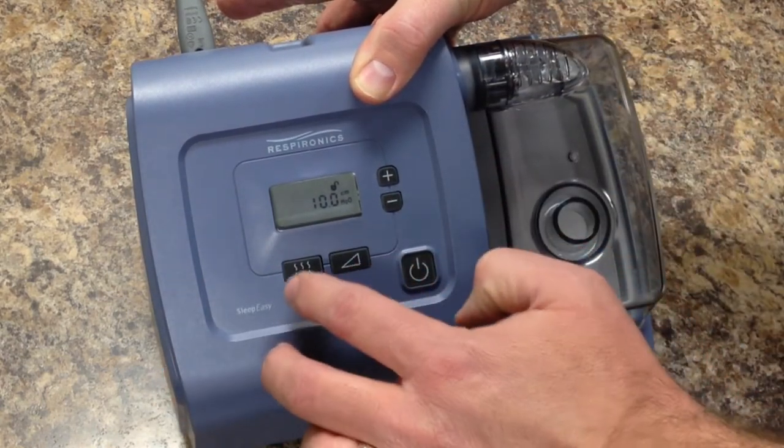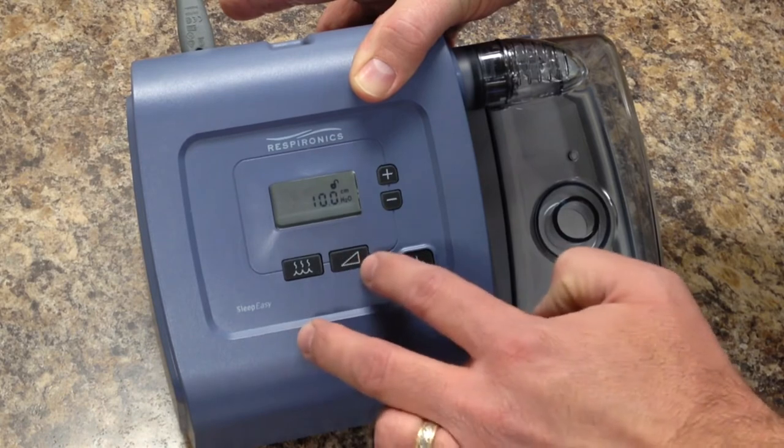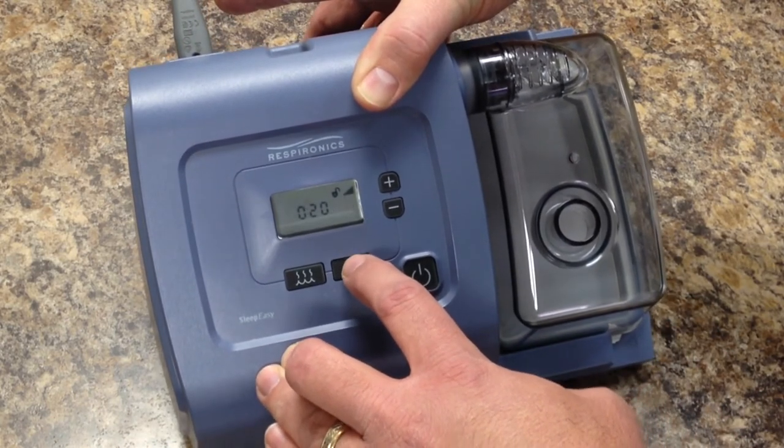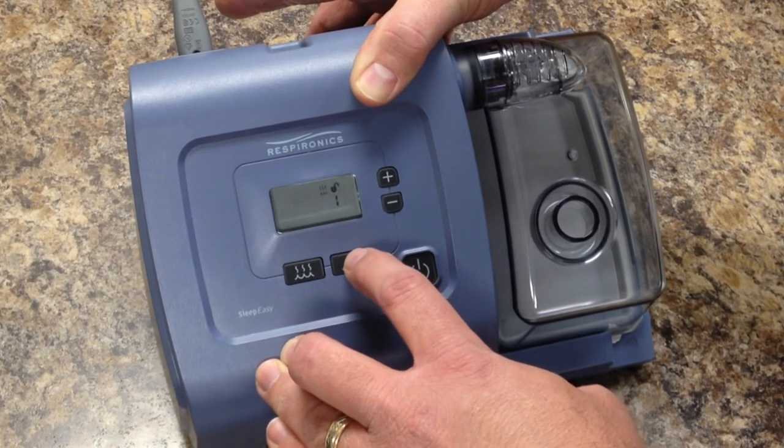To go through those options, you press the heat button and the ramp button. What I'm looking for is the blower hours, so I'm going to press the button until I see the little fan symbol.